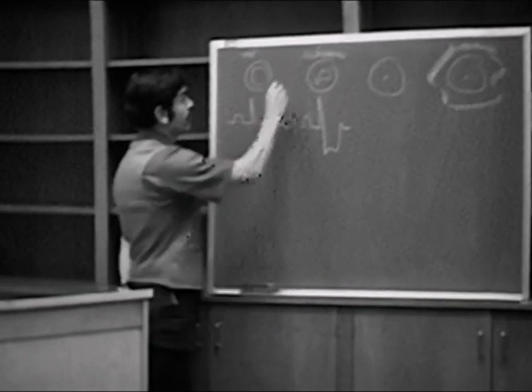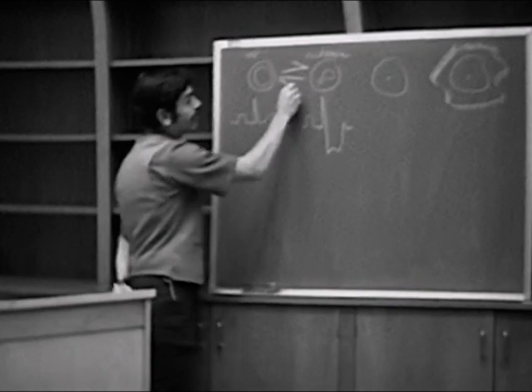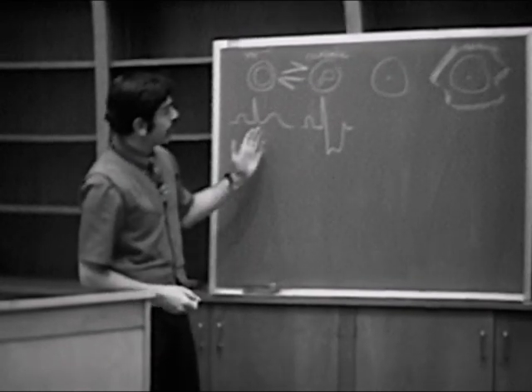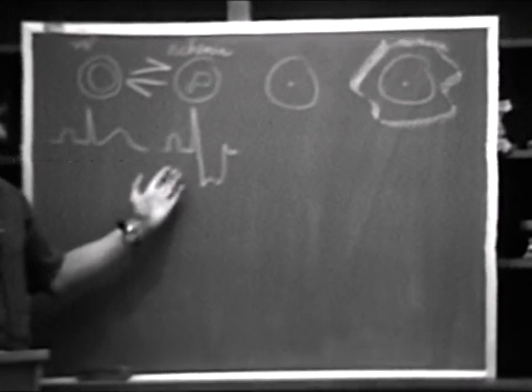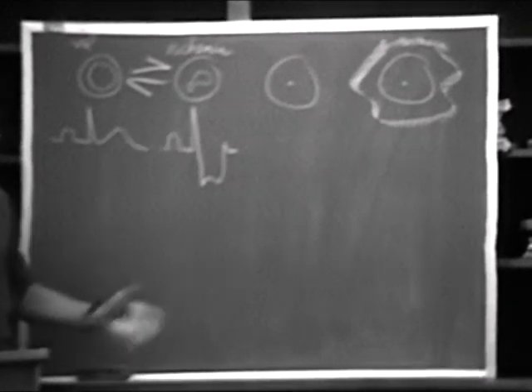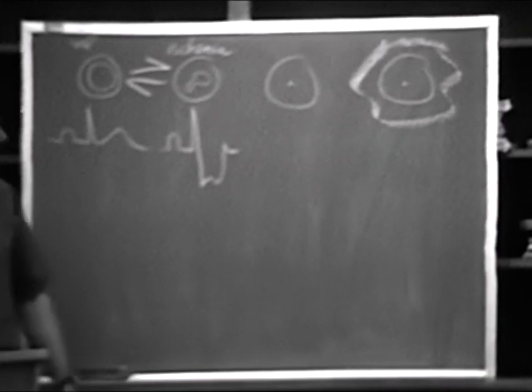And is this situation reversible? Yes, certainly it is reversible. For instance, if someone were to exercise, this is the basis for the Master's test. You can bring out ischemia by exercise, and then it's reversible, and you can go back to a normal electrocardiogram.